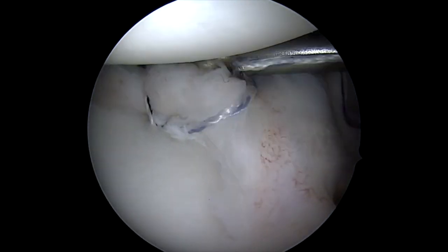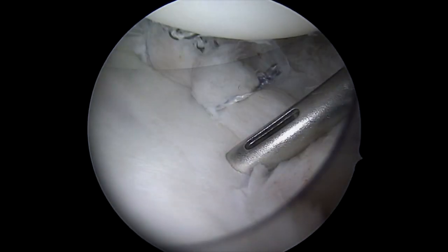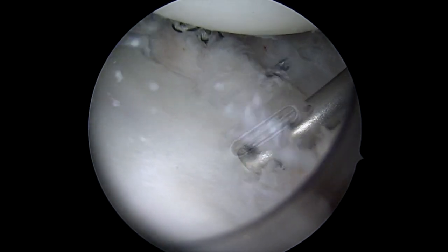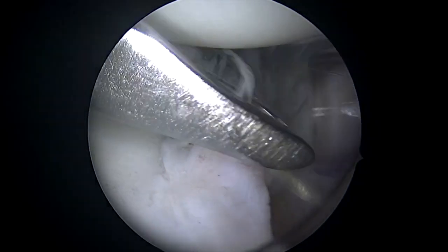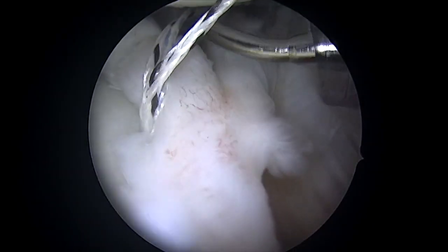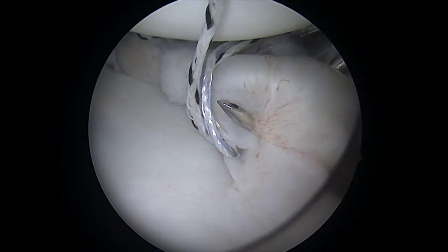You can see me here grasping the other suture and then tying that down. You can see how that brings all of that tissue right up to the edge of the socket. We've got one more anchor to go. This shows us placing our last anchor. Once this last anchor is placed, we're going to pass our sutures around that last bit of remaining capsule — all of this to bring the ligaments around, up, and tighter, to tighten the shoulder and prevent it from dislocating in the future, which is what this patient has been struggling with.